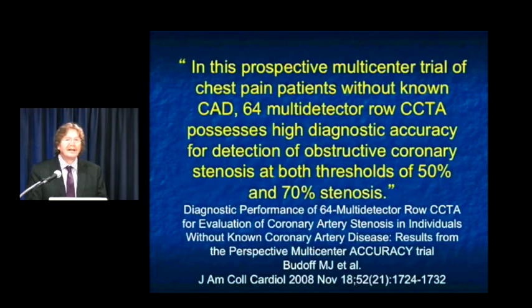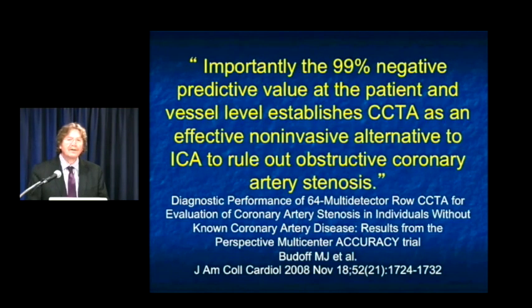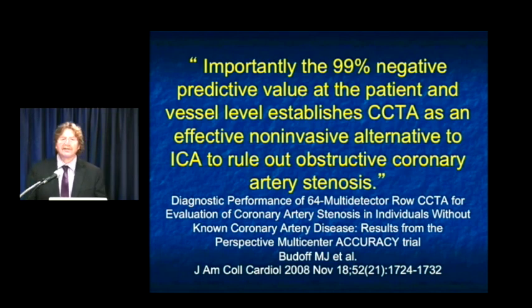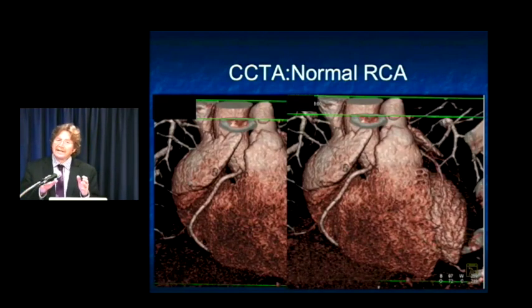The results of cardiac CT have been very good. There are many different articles that show the high accuracy for looking at stenosis. The most important thing in the ER setting is a 99% negative predictive value. If the coronaries are normal or there's no critical stenosis, patients can be discharged. It used to be said that 2/3 of patients who went for cath had a normal cardiac cath. One of the things we do is by being a gatekeeper, we decrease the number of unnecessary catheterizations, which also decreases the number of unnecessary stents. 99% negative predictive value.